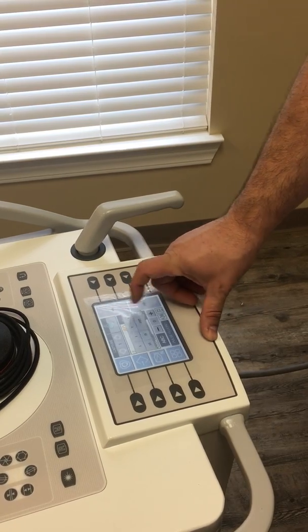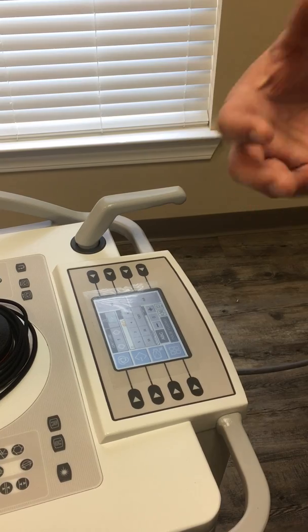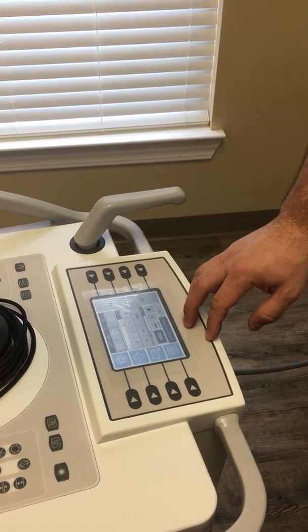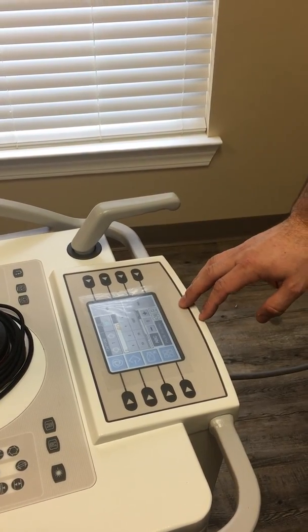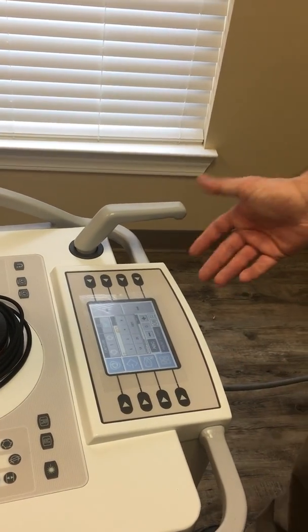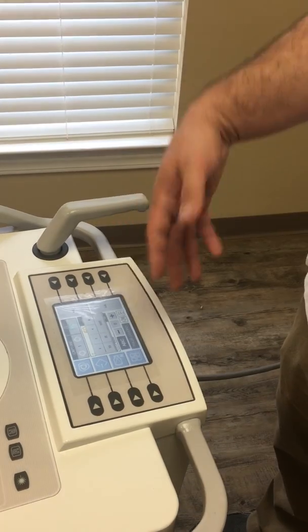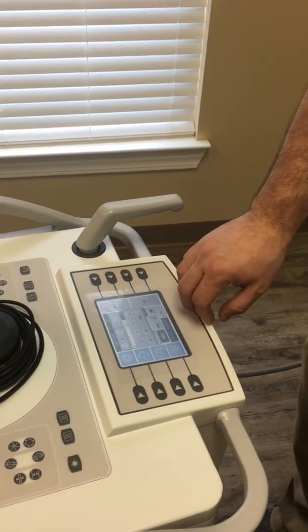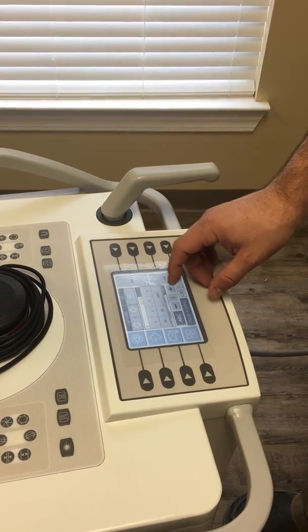Now, if you go under that, to like 8 pulses per second, the image starts to get noticeably degraded. It's kind of fuzzy. And you're using a really low dose, like 60% less, but you have to fluoro longer and take more images because you can't see anything. But that might be something he could be interested in at some point if he wants to reduce dose to himself, his staff, patients, whatever. It's not like you're putting out excessive dose in normal fluoro, but it could be something he's interested in.